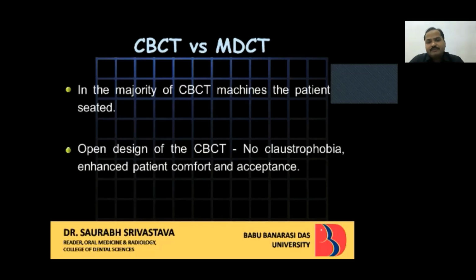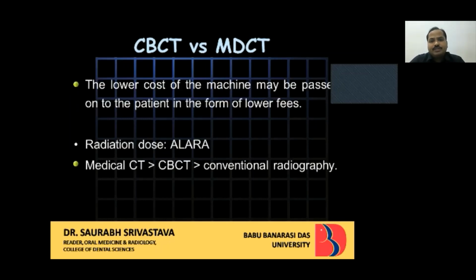In the majority of CBCT machines, the patient will be seated or standing, and with this open design of CBCT, claustrophobia will not be there for the patient, and the patient will be in a comfortable position and will accept the modality of imaging better. The lower cost of the machine may be passed on to the patient in the form of lower fees also. And in terms of radiation doses, it will follow the basic principle of ALARA. As we can see, the medical CT will have more radiation exposure than CBCT, which in turn will have more than the conventional radiographic techniques.